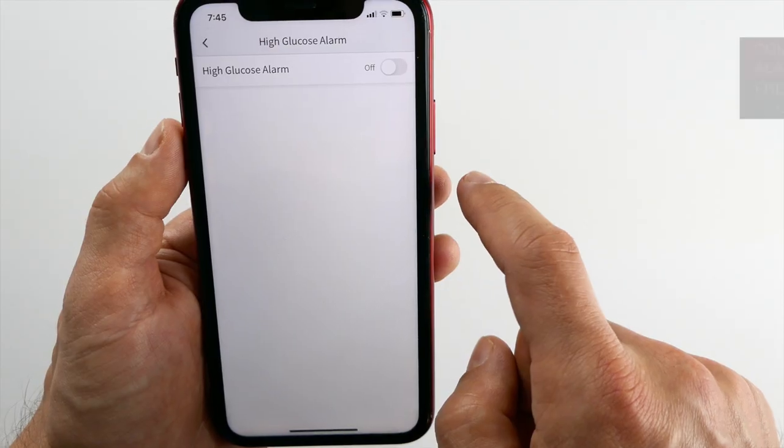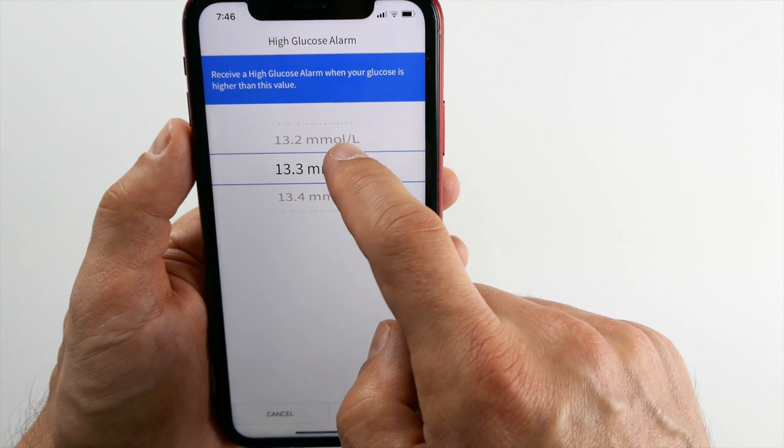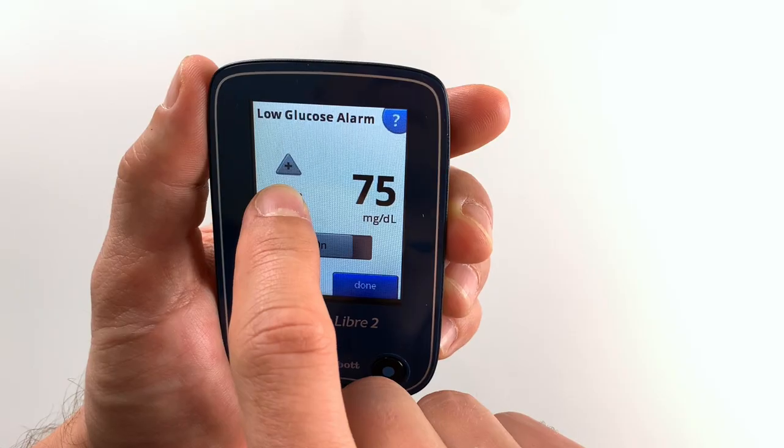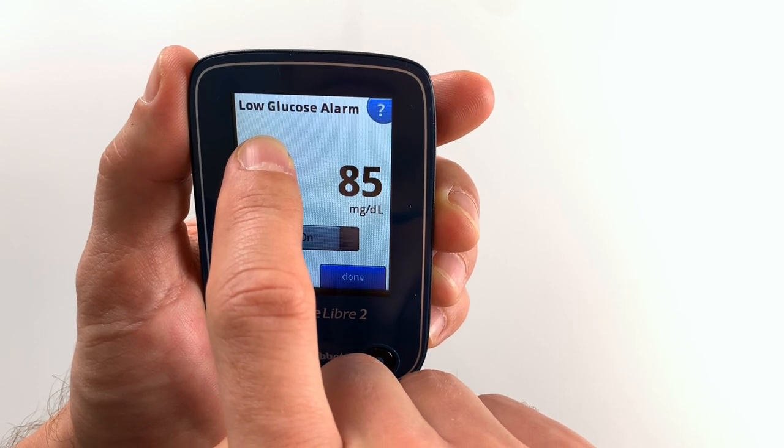In this video I'm going to show you how exactly I set up alarms for Freestyle Libre on my phone and on my reader. No matter which Freestyle Libre you use or what country you are in, you can start using alarms on your Libre right now and improve your blood sugar control. So scan your sensors and let's go!